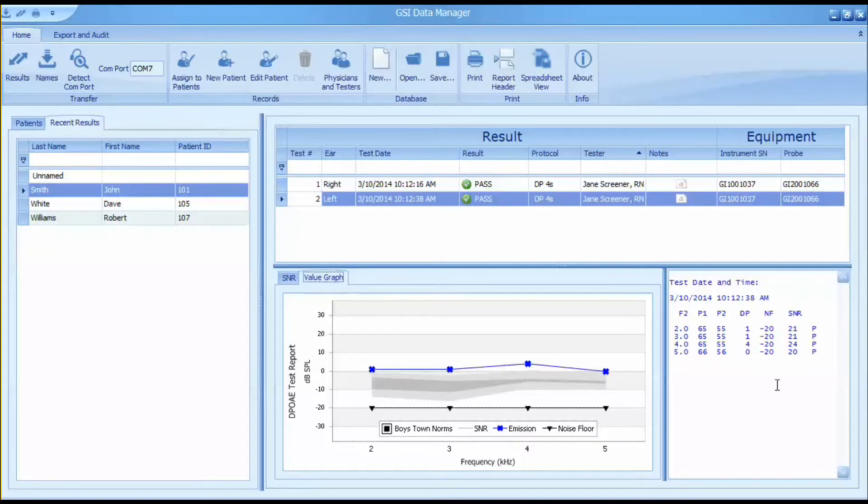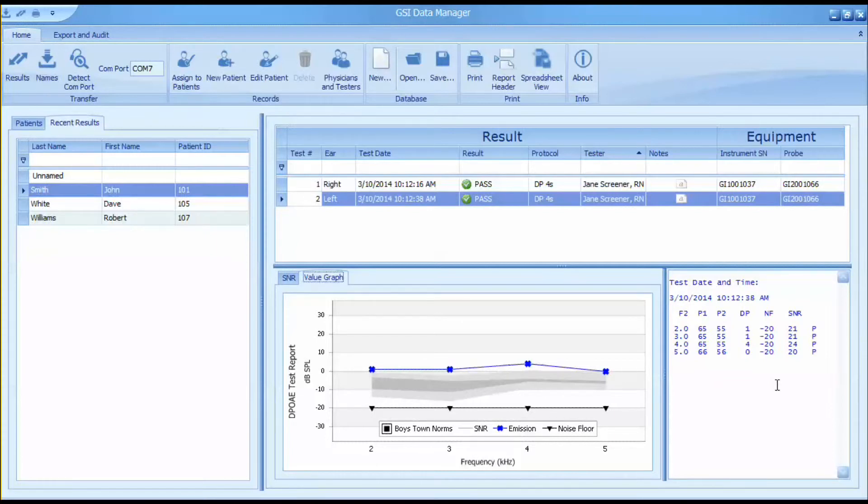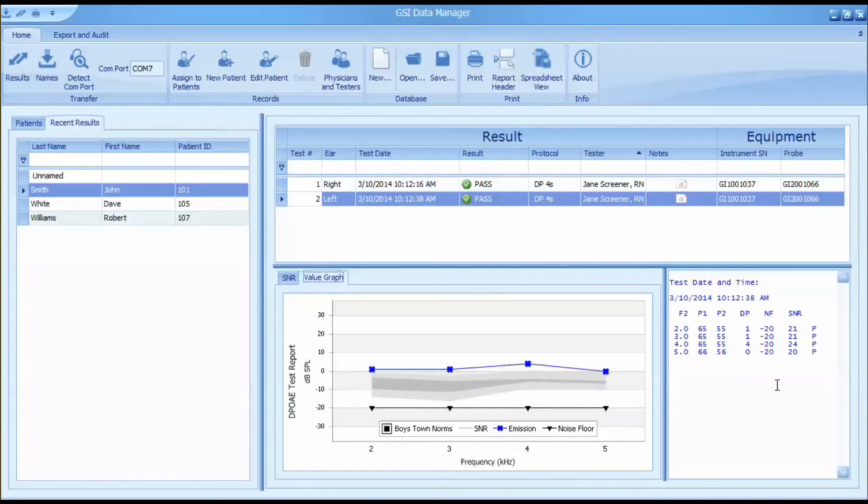Finally, the numerical data is always displayed on the right side which shows all the specific test information including L1, L2, TE or DP level, noise floor, etc. All three of these results will appear in the OAE report.